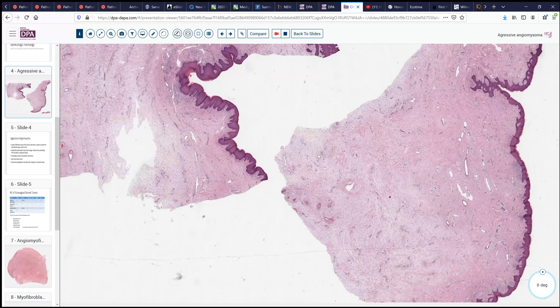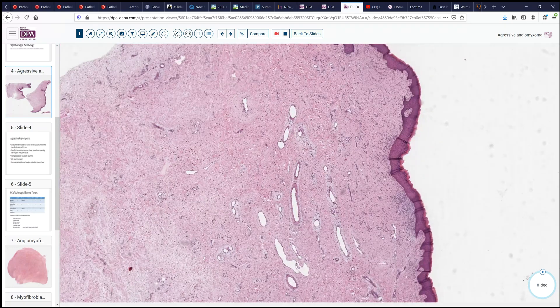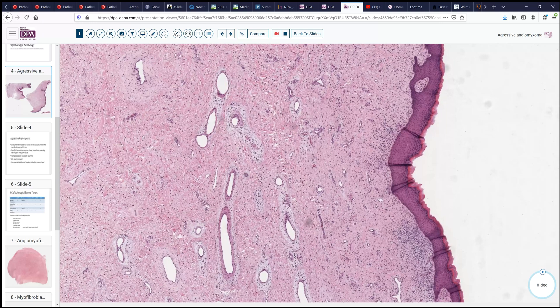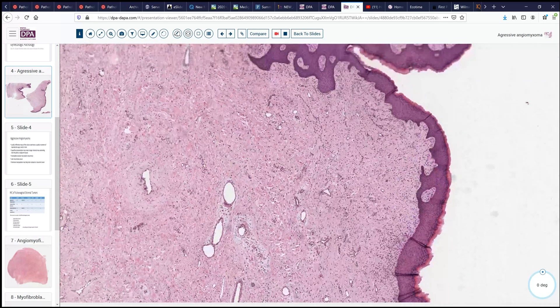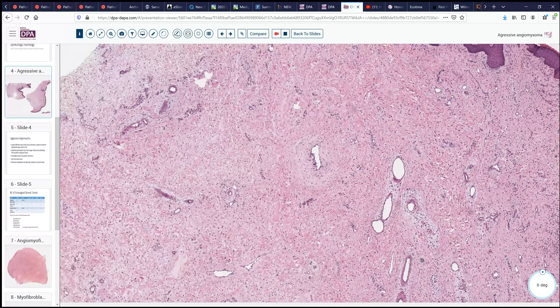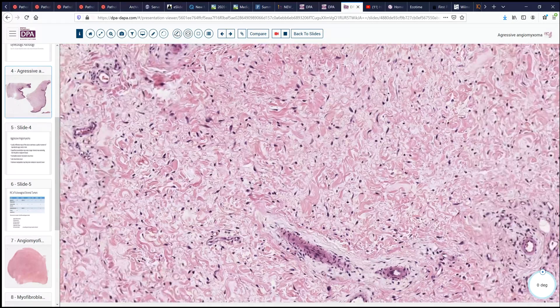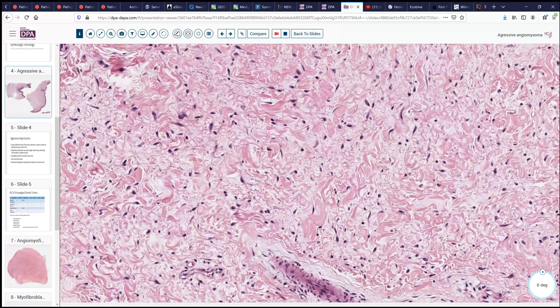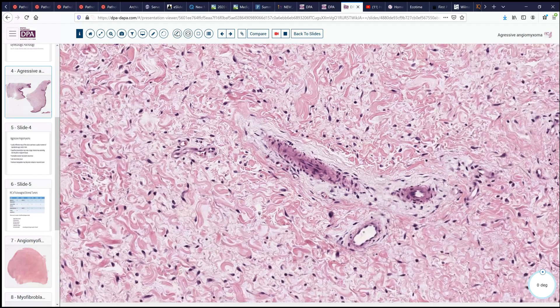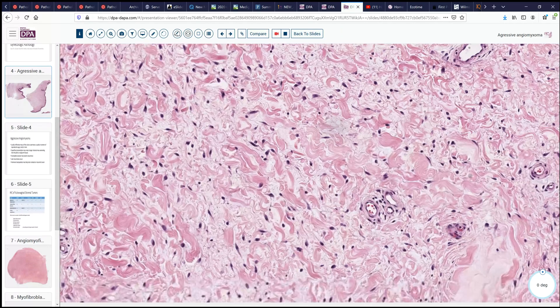Looking at higher magnification, we can see that the squamous mucosa looks to be fairly unremarkable. There is hyperkeratosis and some chronic inflammation, and then our normal submucosal, maybe slightly erectile-type tissue. Deep to that, there is a very gradual transition to a mixture of very loose myxoid tissue with collagenous bands running through it. Looking at these cells, we don't see any particular atypia. There may be a few mast cells, and we see vessels of varying sizes — small arterioles, veins, and capillary vessels.